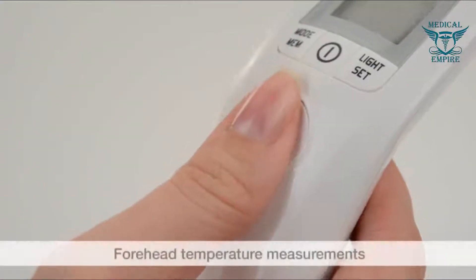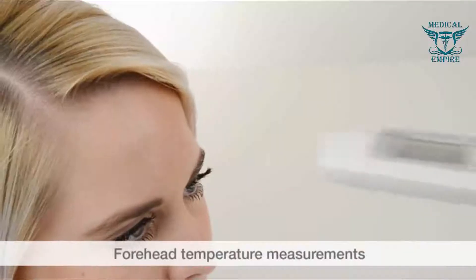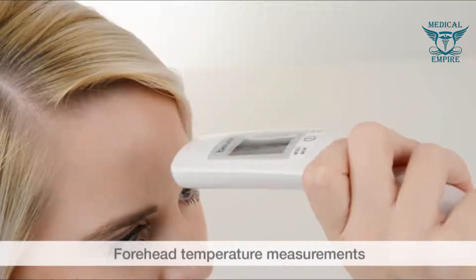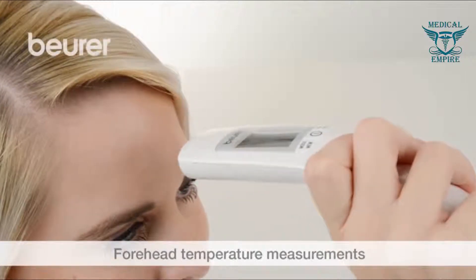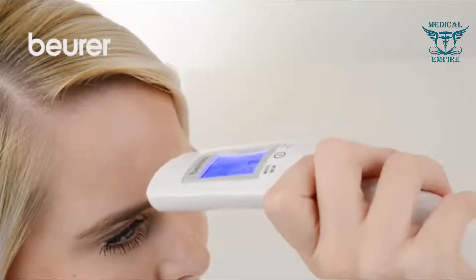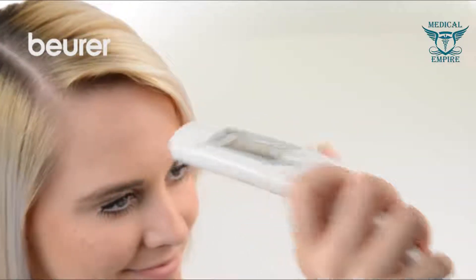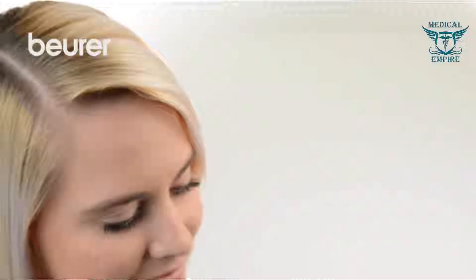Press and hold the scan button and move the device from side to side, two to three centimeters from the measuring area on the forehead above the eyebrows. A long beep signals the end of the measurement. Let go of the scan button and read the temperature.